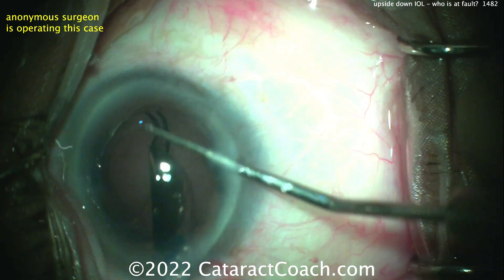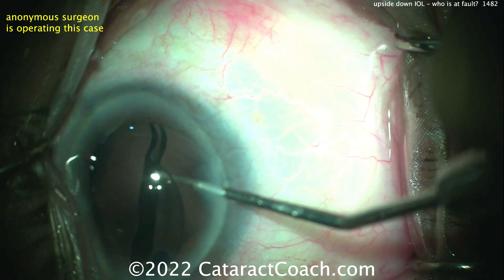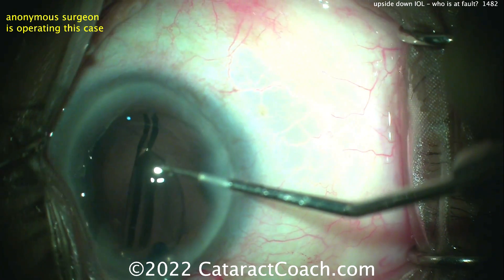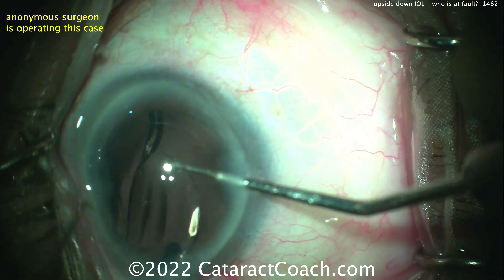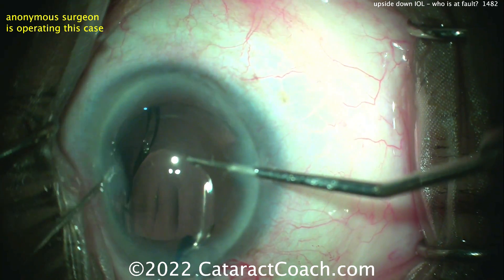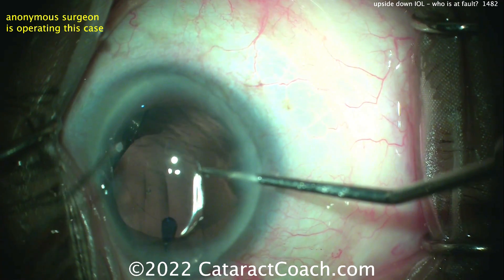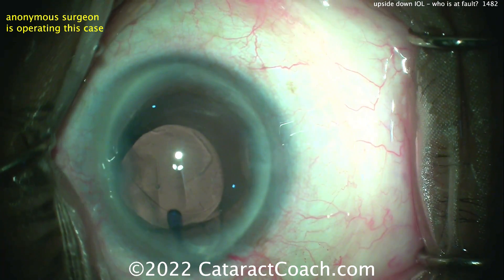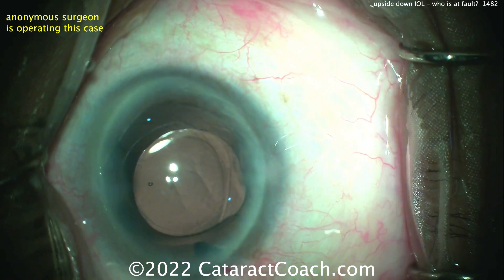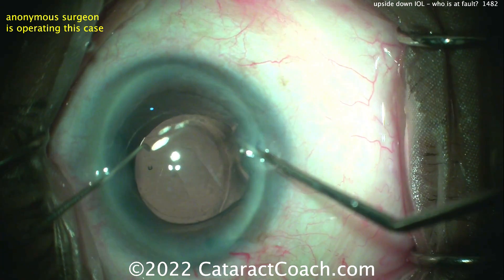The surgeon is going to flip it the wrong way again. The lens started to go inside the eye correctly, but when it went on its edge that's exactly why the 7L rule matters — figuring out which orientation is correct. If you always think 'first haptic must look like a number seven as it enters the eye,' you can address it. And sure enough, there's the S-sign: this lens is in the eye upside down.